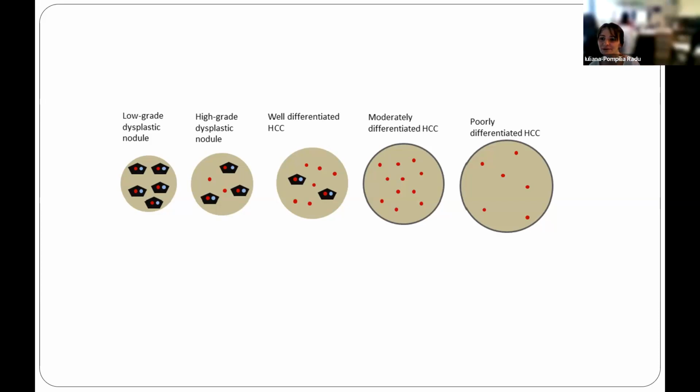Just wanted to ask you if you have some experience or some insight in the quantification of contrast, because there are softwares that allow it. I think this would probably be a way to reduce the variability, the inter-observer variability.